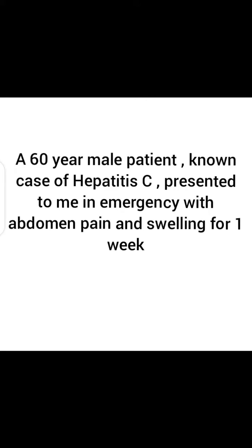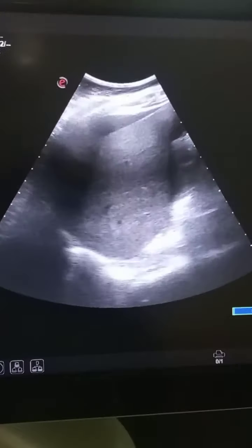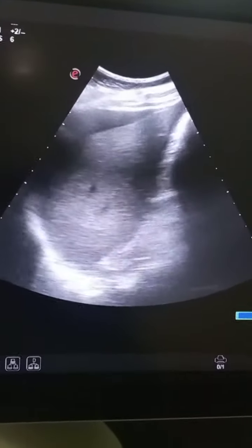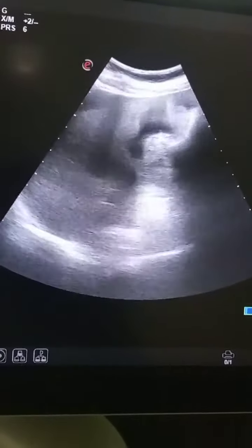A 60-year-old patient, known case of hepatitis C, presented to me in emergency with abdominal pain and swelling for one week. Let's do an ultrasound of the abdomen of this patient.